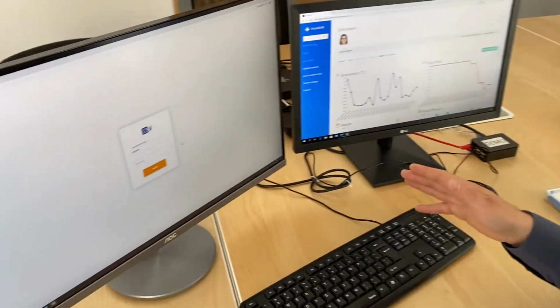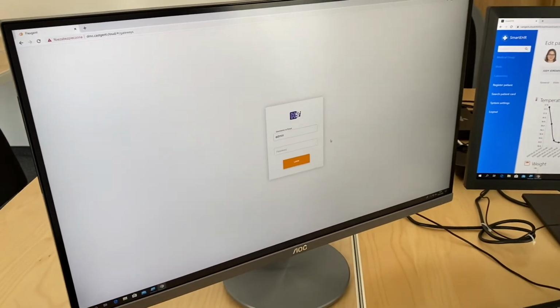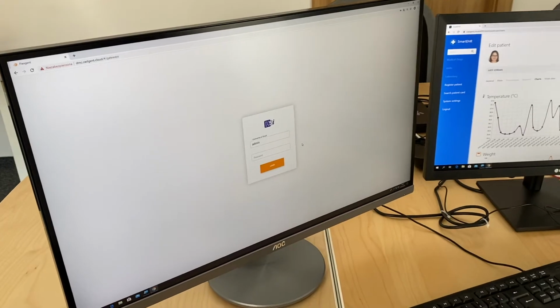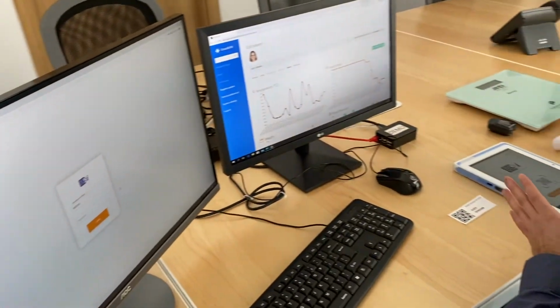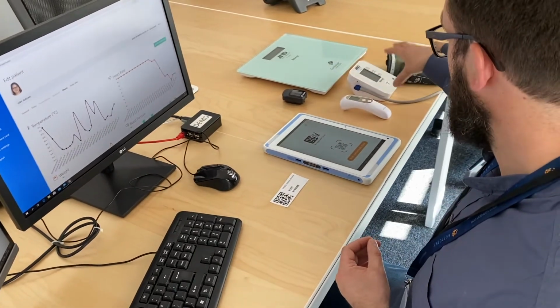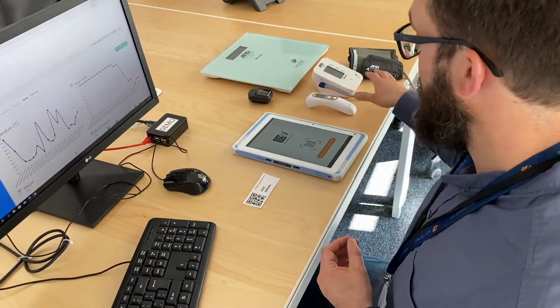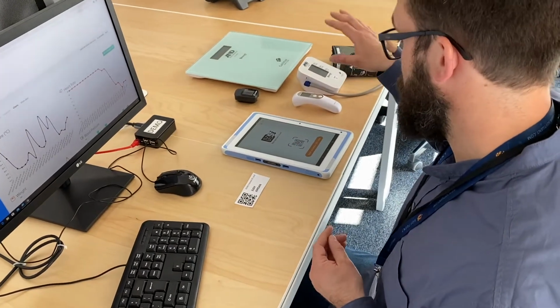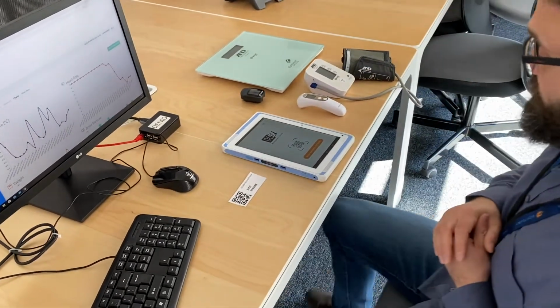On the left side, you see an instance of our management application that is intended for hospital IT personnel. That application allows you to monitor the health of these devices and also provision some of these medical devices to that gateway to allow secure and proper communications to enable patients to use only the devices that we want.